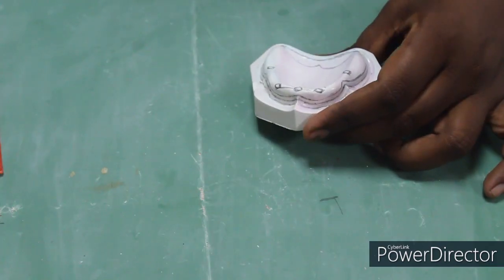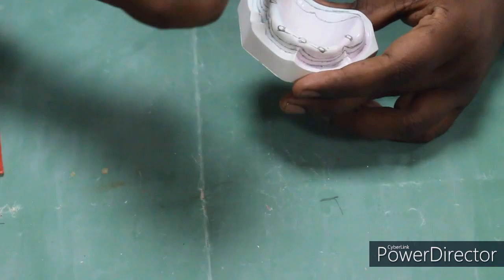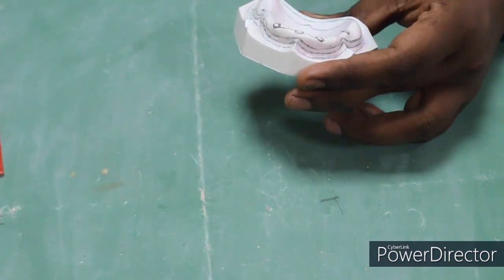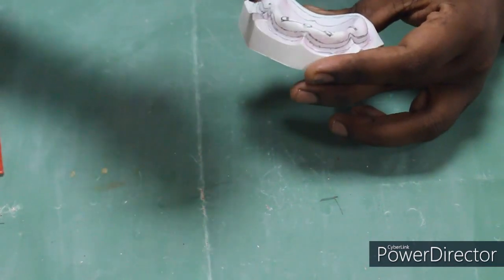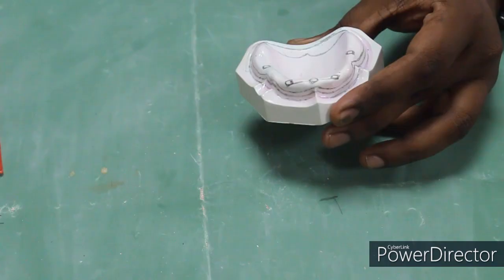If it comes in contact with the calcium sulfate, it forms calcium alginate and sets on the cast surface to form an impermeable thin layer. That will act as a separating medium for the acrylic so it does not bond to the cast surface.